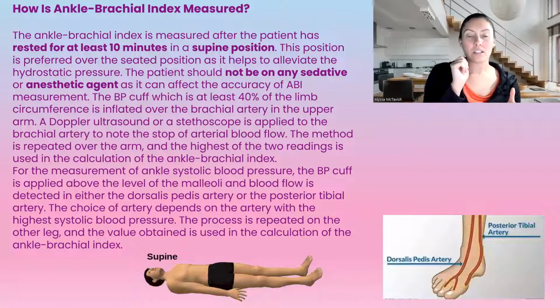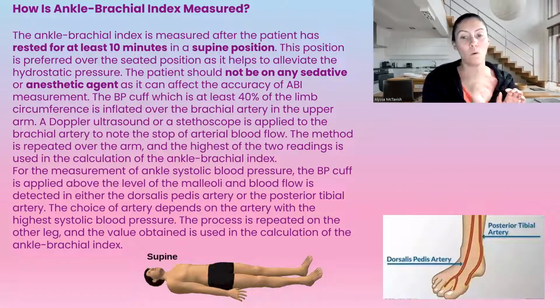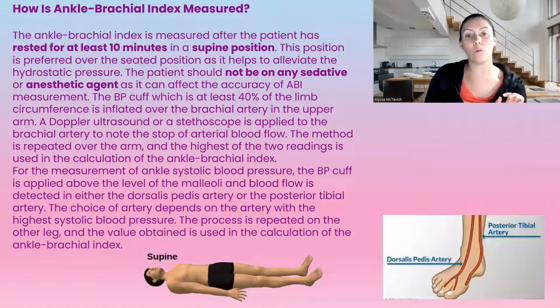As soon as we hear a sound, we look at the number on the blood pressure cuff. That's the systolic number, and we write that down.